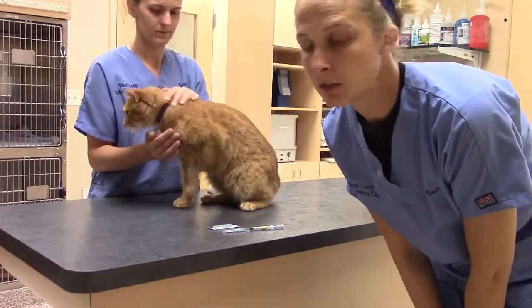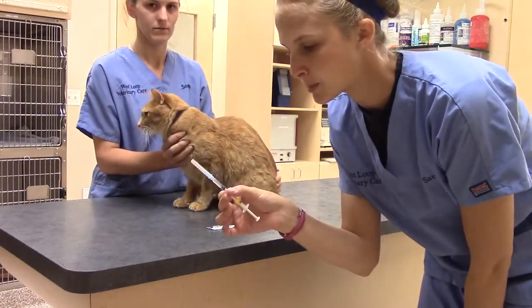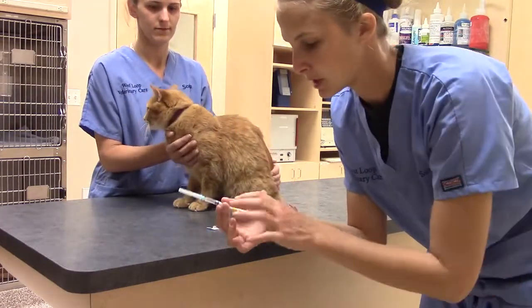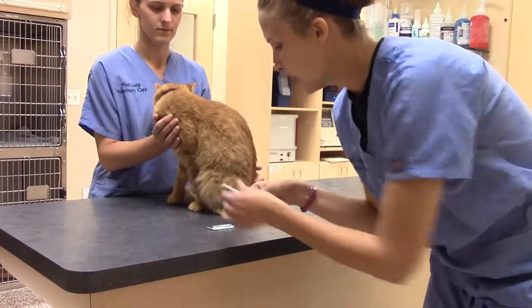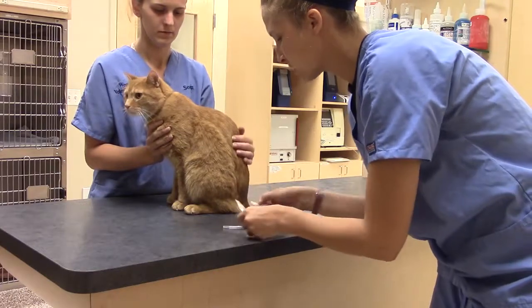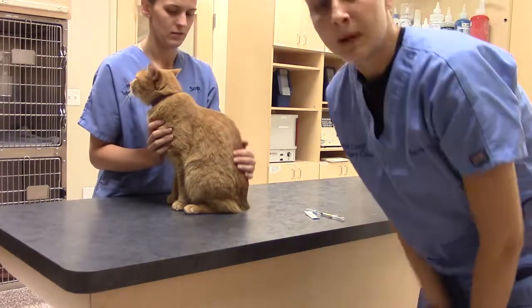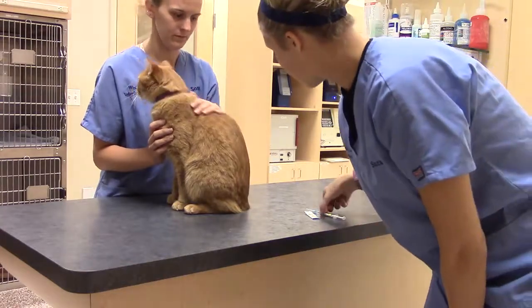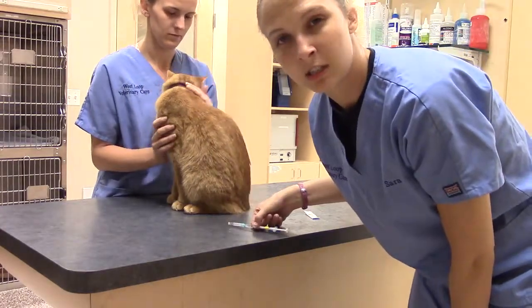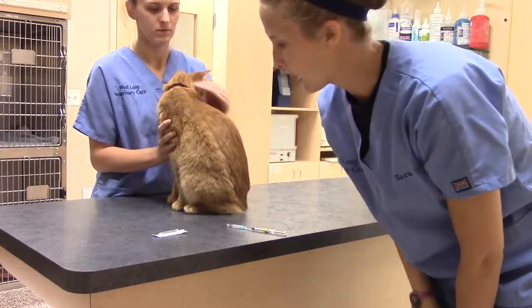So we're going to be doing a sub-Q injection on our friend here. I've already pulled up the Convenia — it is 0.3 mL, which is confirmed with the label as well. I'm going to switch out needles so that it's as sharp as possible, keeping comfort for our patient. I'm going to be using a 25-gauge needle, which is a small needle to help with that. Convenia is not viscous, so I don't need to worry about it getting clogged.